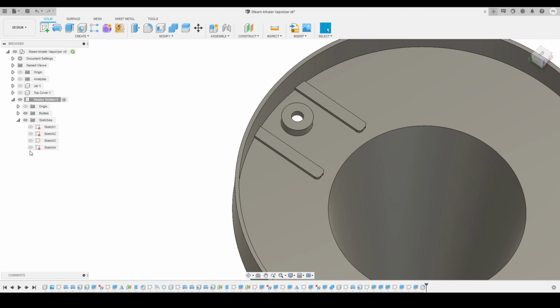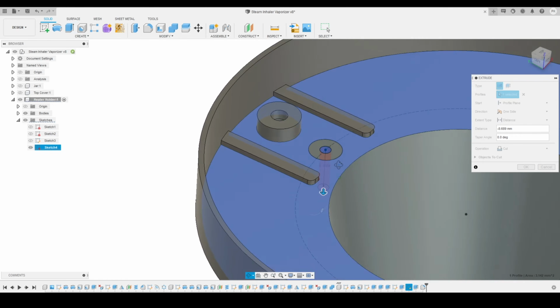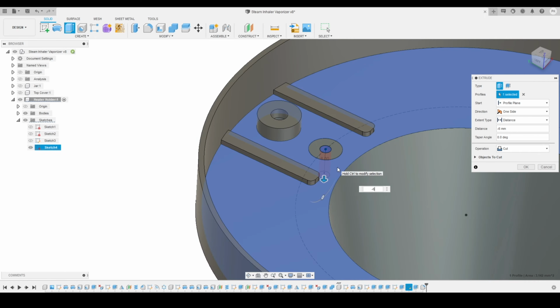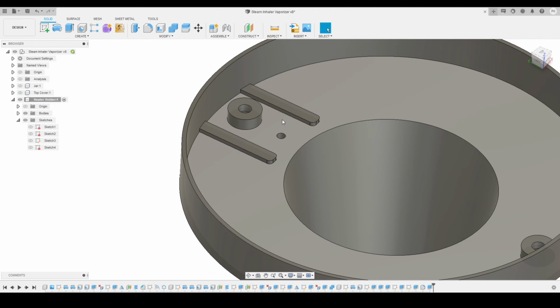Now again I will turn on our sketch and activate the extrude tool, and this time I'm going to create a hole like this. Since the total length was 10 millimeters, I will just create a hole up to -6 millimeter and press OK. So guys, there is a small problem here, so I think I have to edit my sketch again.